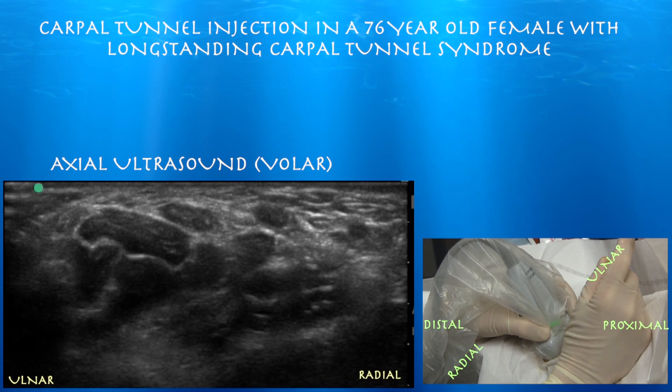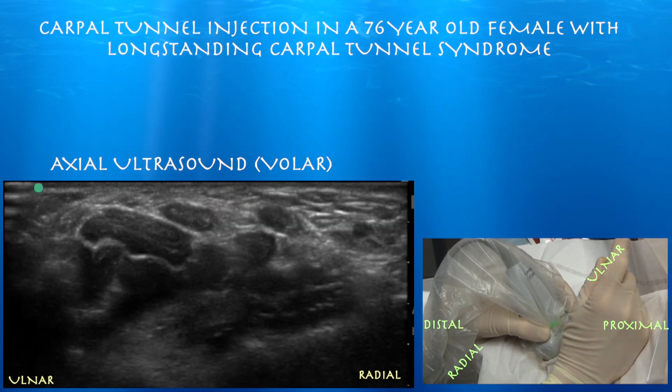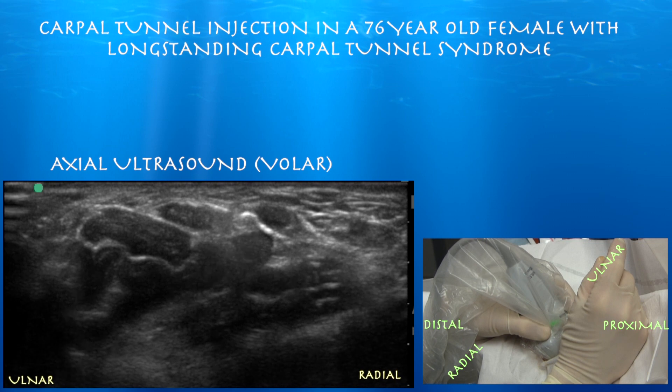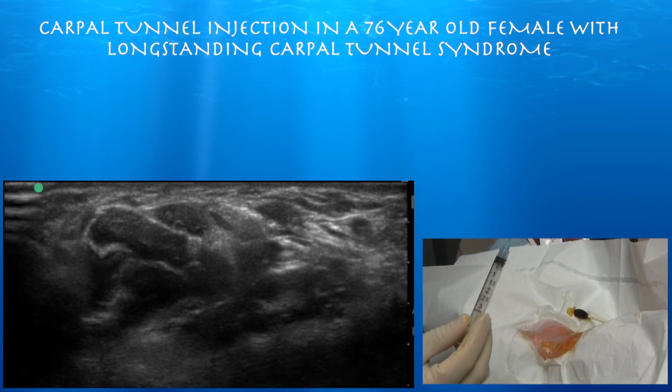Injecting now. Here's our initial flash and it's right on top of the nerve, and under the retinaculum you can see it spread throughout the carpal tunnel. This lady wound up having a good response to the injection, but it didn't take care of all of her pain, so she wound up getting carpal tunnel release.